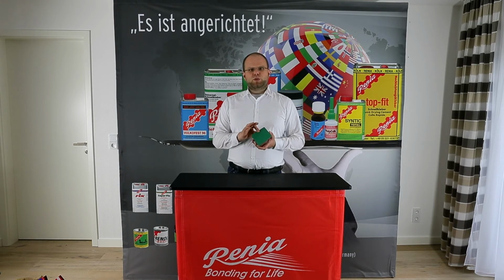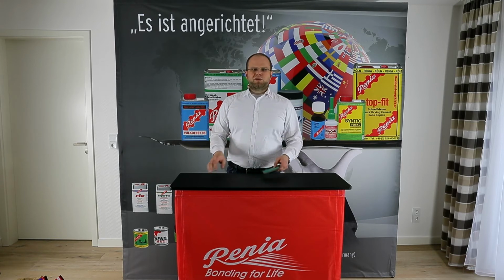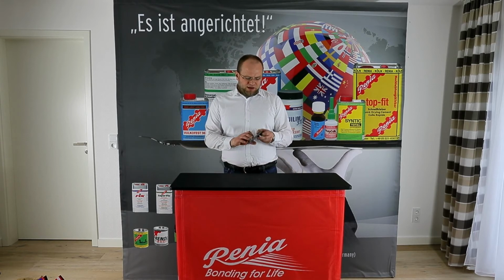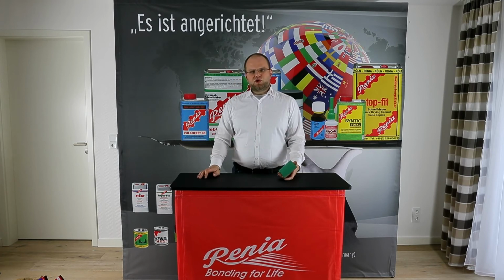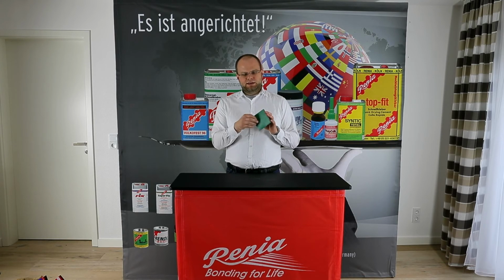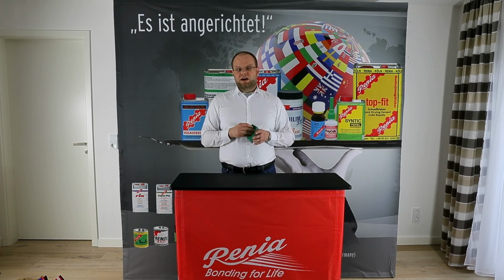Sometimes this is used in between layers in a sandwich construction, sometimes it's used on top of things. One word of caution, if you're using this as a top cover, of course you will get a very, very soft bedding effect, but keep in mind polyurethane, even if we are talking about a closed surface like this one here, polyurethane foam is water absorbent, absorbs fluids, and that includes fluids seeping out of wounds, seeping out of cuts, and if it gets into the foam, once you have a little bit of a cut or a rip in the integral skin on the outside, it will penetrate, the foam will soak it up, and then it's very, very difficult to get out of there and to keep it clean.